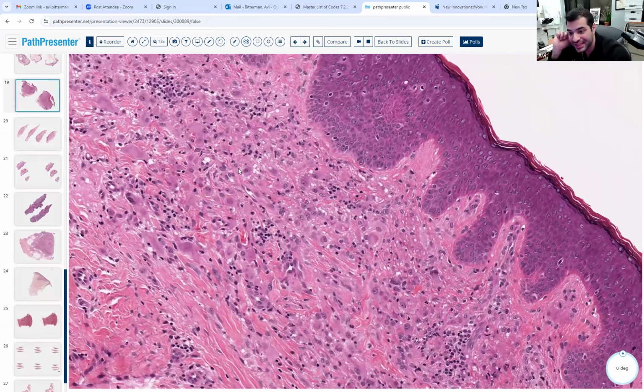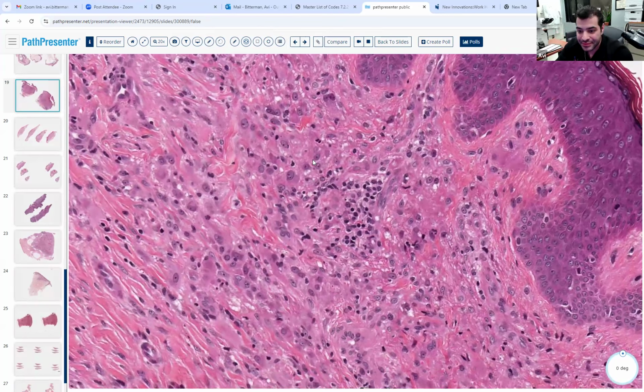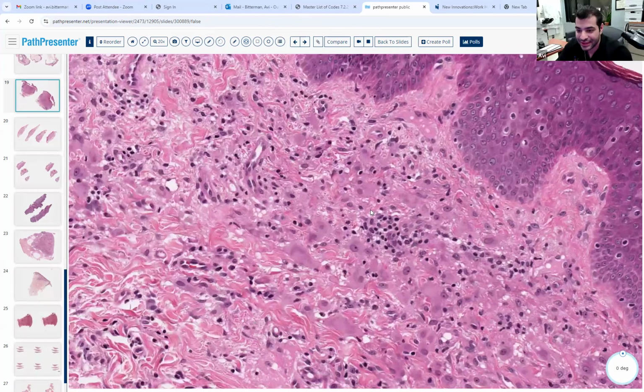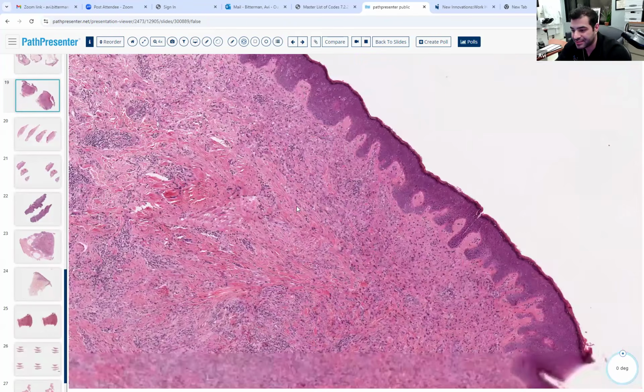And you see how all these cells clearly have, some people also say, discrete patterns where they almost look like they're in their own lacunae. So what's that good for? Reticulohistiocytoma or reticulohistiocytosis. If this is a solitary lesion, what does it mean for the patient?